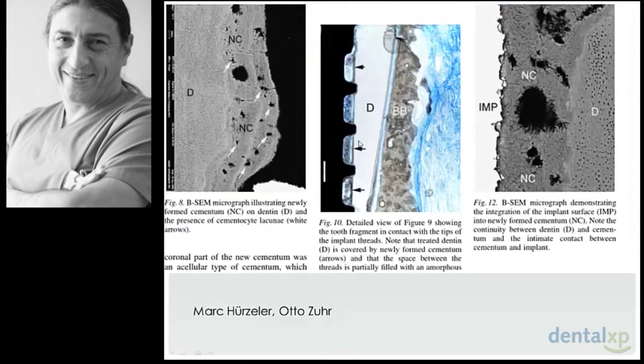Also, when we magnify this relationship, when it's in contact, you can see that the surface of the implant also integrates in this new cement that is in some part with the presence of cementocytes here.